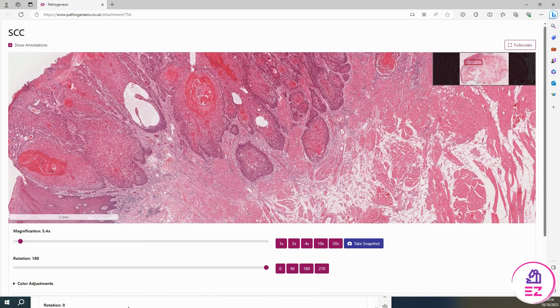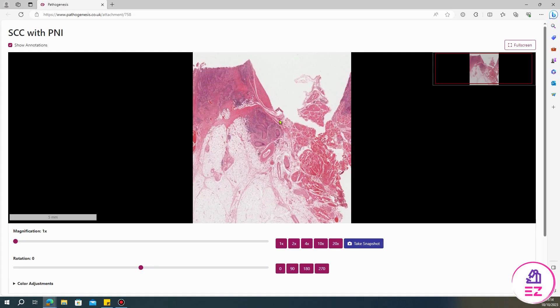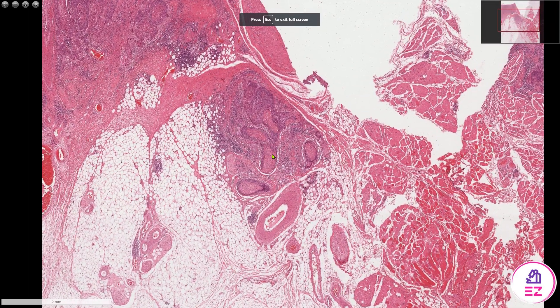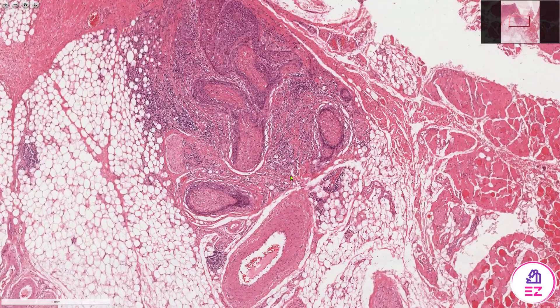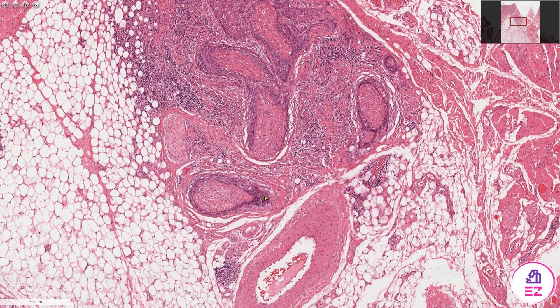I just wanted to show you another example of a squamous cell carcinoma, because this one shows perineural invasion, which along with lymphovascular invasion are other things we'd comment on. We've got five lots of nerve bundles, and you can see that we've got squamous cell carcinoma wrapping around those nerves. This is associated with poor prognosis and local recurrence.